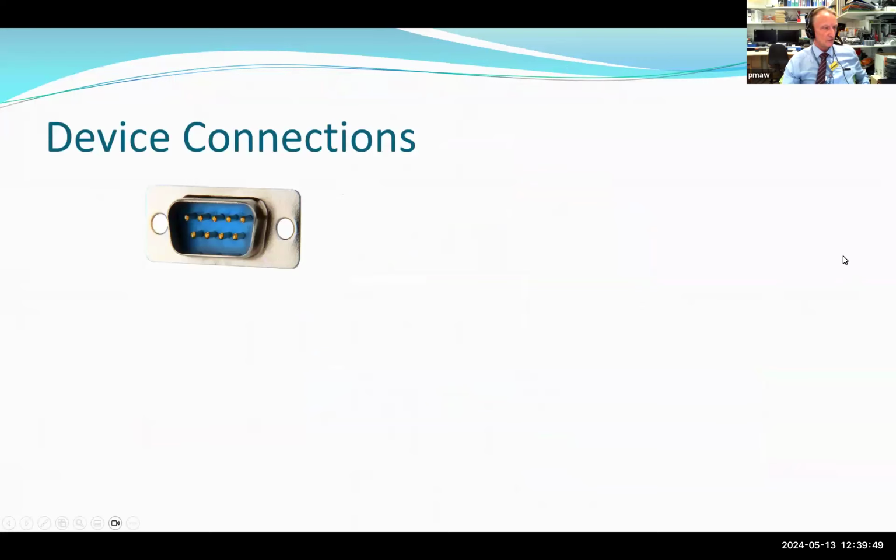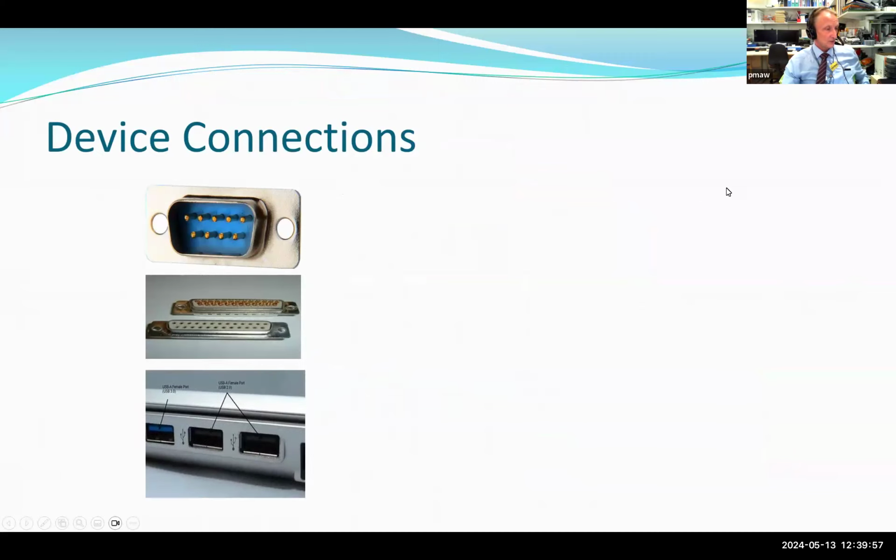None of this required new devices. All the devices that we connected had existing hardware connections, good old D types, USB connections for some of them. So it didn't mean that we had to throw away all of our old kit and get new kit. We used existing kit.